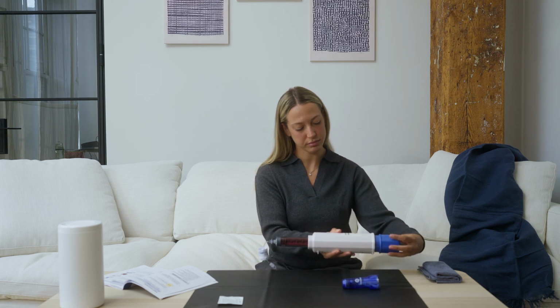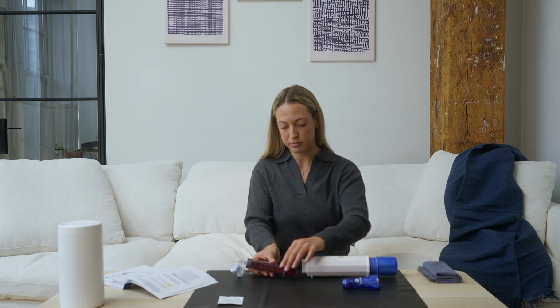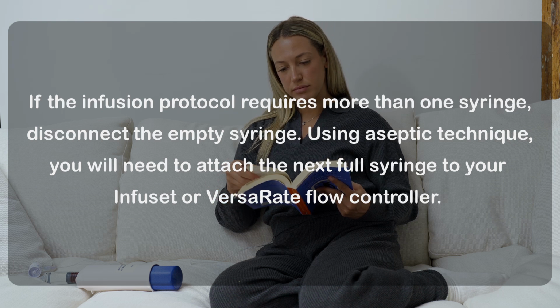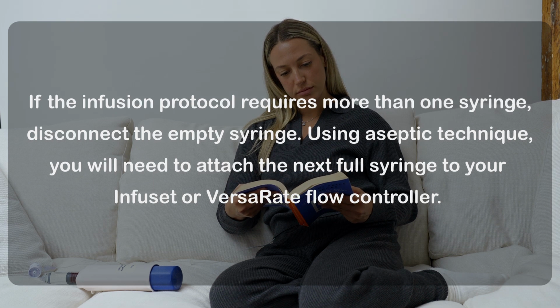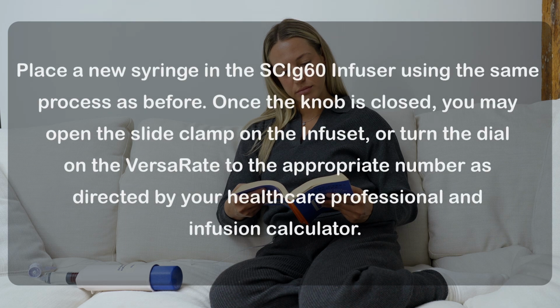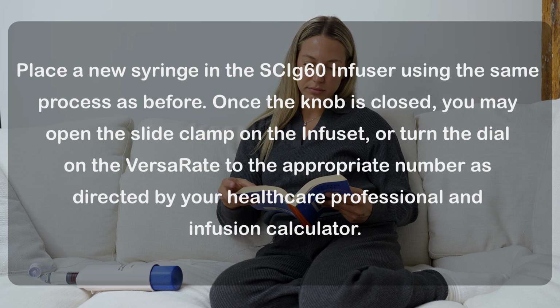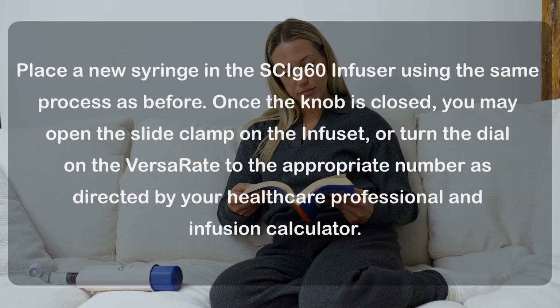Once complete, you may untwist the knob of the SCIg60 infuser and remove the syringe. If the infusion protocol requires more than one syringe, disconnect the empty syringe. Using aseptic technique, you will need to attach the next full syringe to your InfuSet or VersaRate flow controller. Place a new syringe in the SCIg60 infuser using the same process as before. Once the knob is closed, you may open the slide clamp on the InfuSet or turn the dial on the VersaRate to the appropriate number as directed by your healthcare professional and infusion calculator.